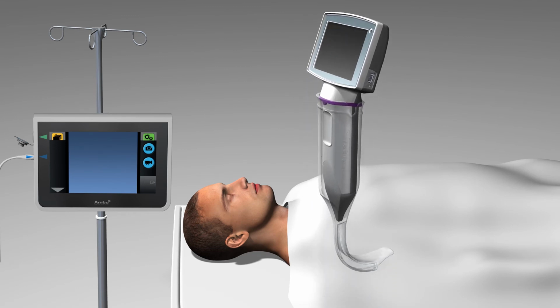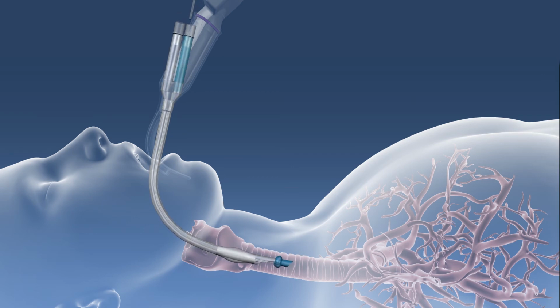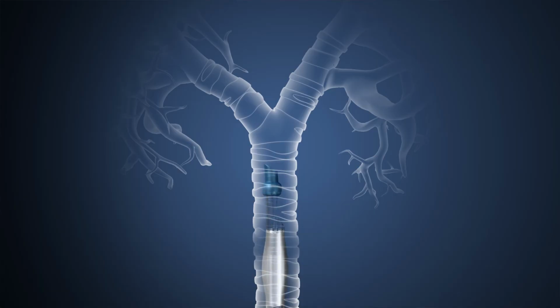Using a laryngoscope to visualize the vocal cords, insert the double lumen tube following a standard procedure. Once the tip and bronchial cuff have passed through the vocal cords, use the aScope to position the double lumen tube in the normal manner. Once the position of the bronchial cuff is confirmed, inflate both the tracheal and bronchial cuffs and remove the aScope.